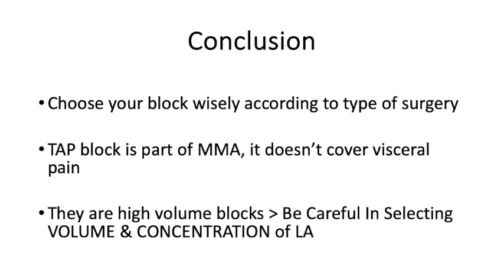These are high volume blocks, especially when you are using them for laparotomies with incision from xiphoid to the pubis, because you have to give bilateral TAP along with bilateral rectus sheath. So you will require roughly 70 ml of LA: 20-25 ml for each TAP and 15 ml for each rectus sheath. So what I do is I take 0.75% ropivacaine 20 ml and dilute it up to 70 ml, so 20 ml ropivacaine and 50 ml saline. It makes my 70 ml of LA. It is roughly 0.2% ropivacaine, and I give it for bilateral blocks. So this is how you can give the TAP block.